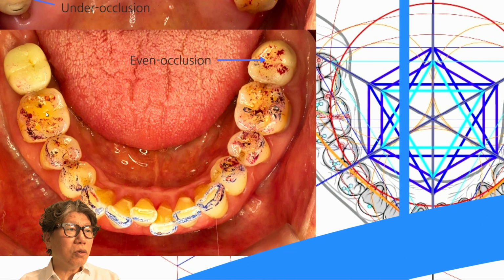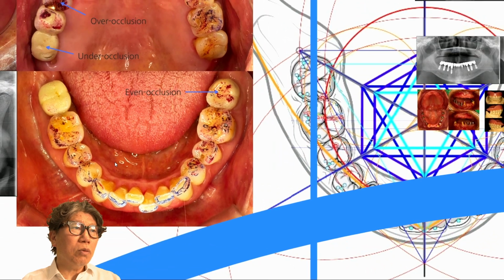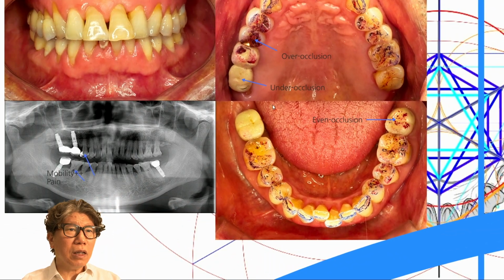The patient talks about various symptoms, such as sensitivity in this natural tooth and some response to thermal stimuli. However, there are not many treatments I can offer. So, I suggest to the patient that we try adjusting this area again, and I think this tooth was extracted and replaced with an implant. I believe they used an implant called SS2 from Company O here. So, this seems good, but in my opinion, it doesn't have much difference from other implants. Anyhow, this is what happened.